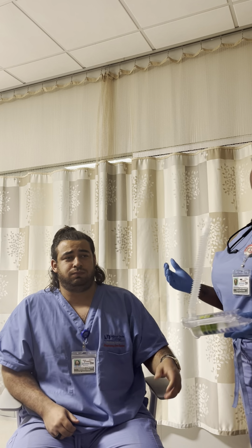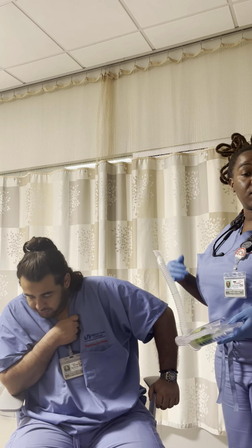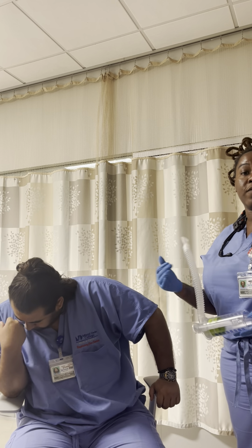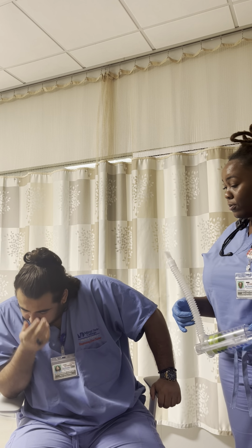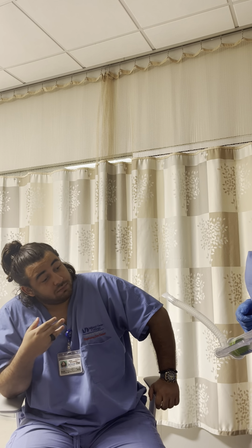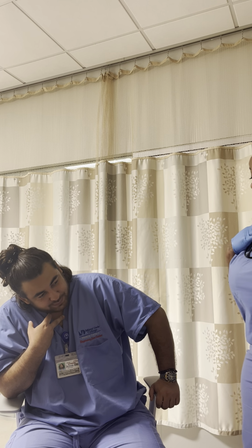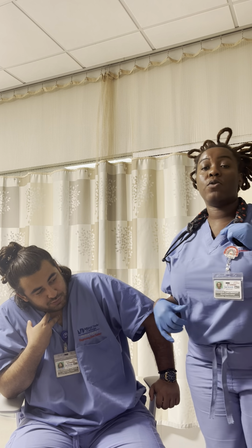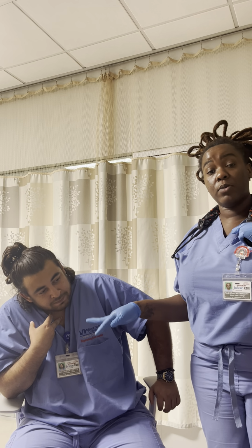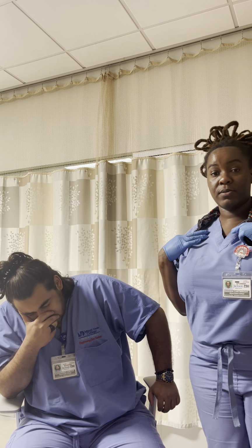Now the patient is going to take several normal breaths. So after this, he's going to breathe normally for several times, okay? Good job. Good job. So after the patient has performed a maneuver, going to assess the vitals again, okay?